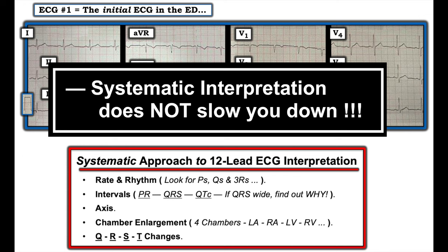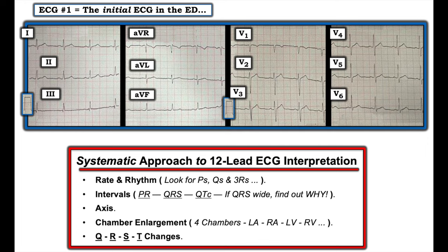The reason it speeds you up is that people tend to go back and forth and say, did I look at this? Did I not look at this? If you're using a system, it totally organizes you. It makes you sound like you really know what you're doing along the way. It narrows down your differential diagnosis and you do it in real time.